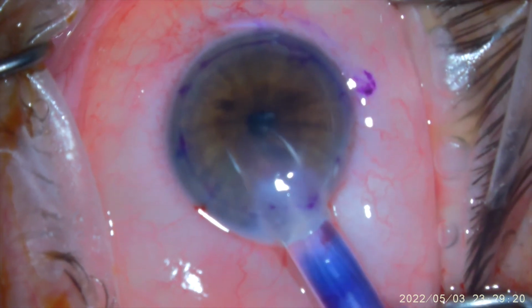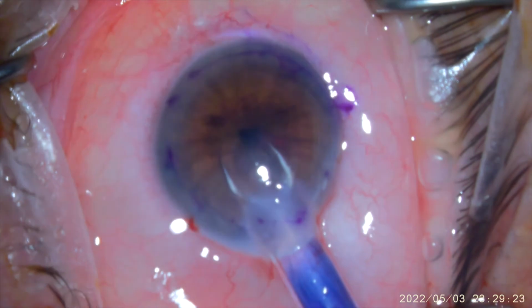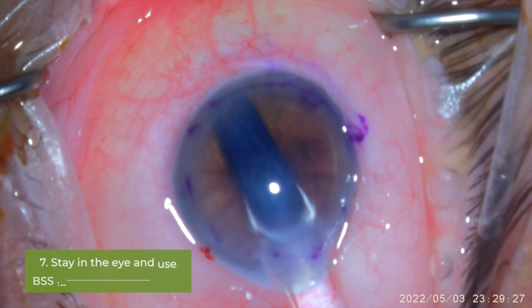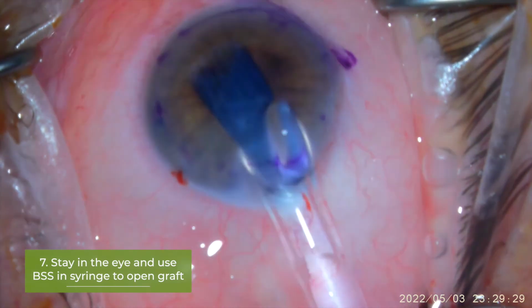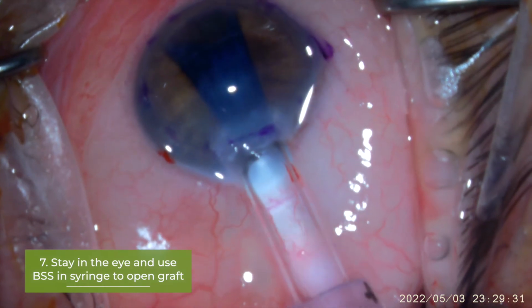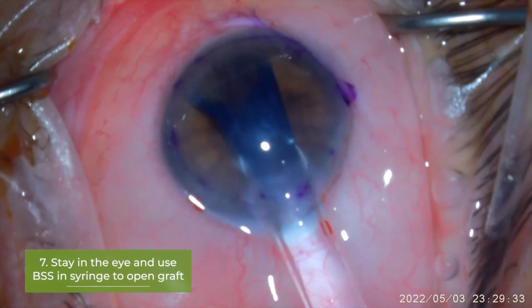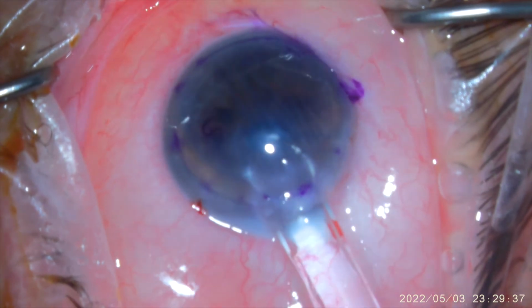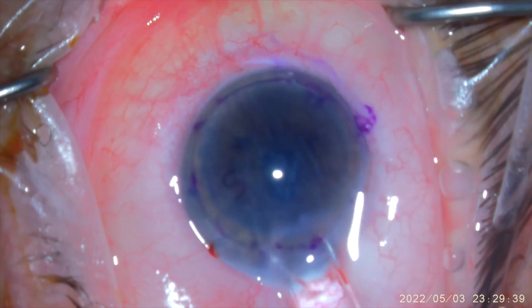Once I'm in there, I start injecting in pulses, quick little pulses, and eventually the graft should come out nicely. Now the most important part here is do not come out of the eye too quickly. Stay in the eye. You saw I went almost back in, further into the eye. Keep injecting in pulses to unfold that graft and twist the cannula as needed.